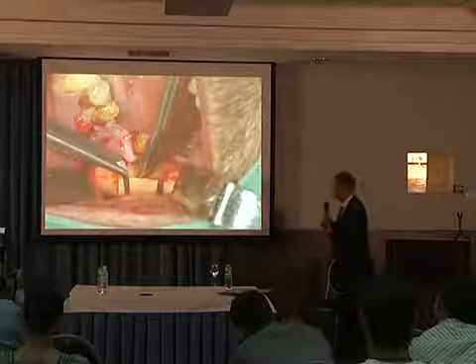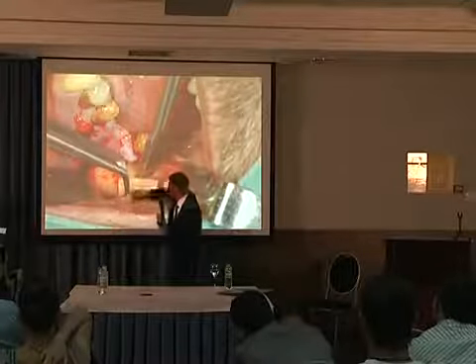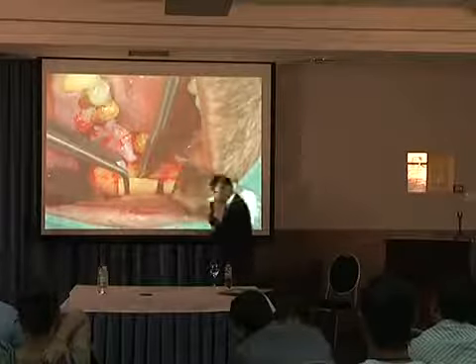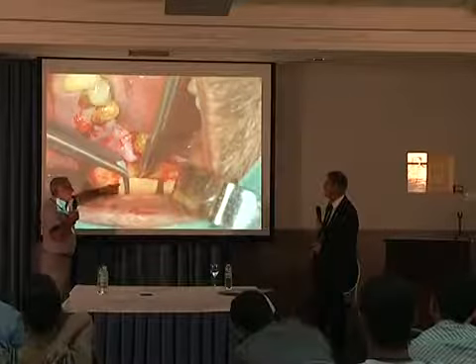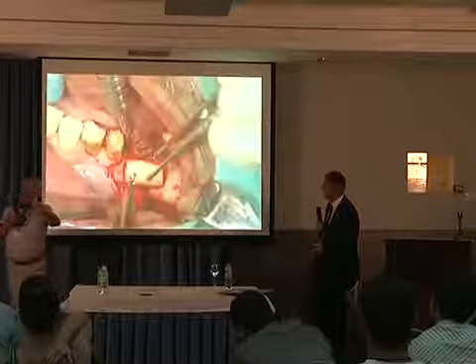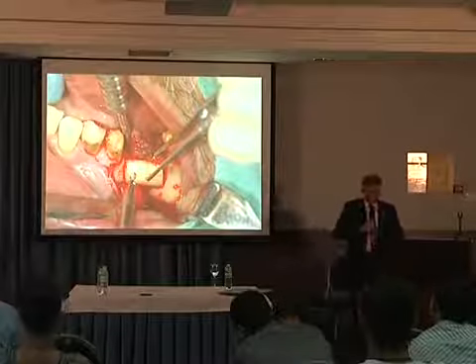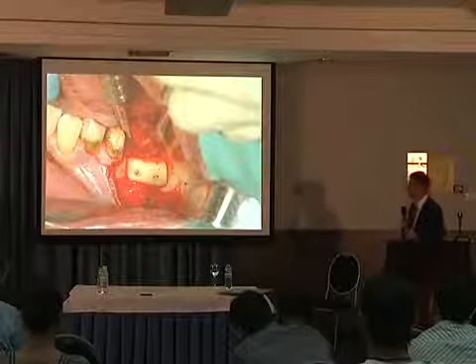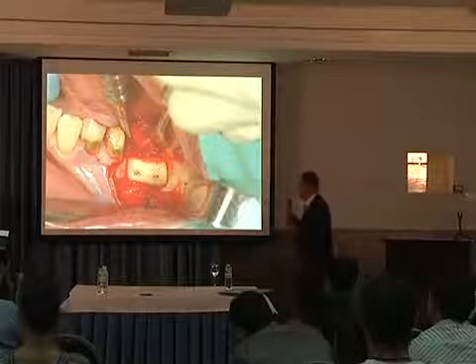You measure the size of the defect precisely. In the same area, just a little bit down and distally, with piezo surgery, we are harvesting a monocortical bone block from the body of the alveolar ridge. Fixation of the bone block with mini screws. Normally 2 screws to fix this block.